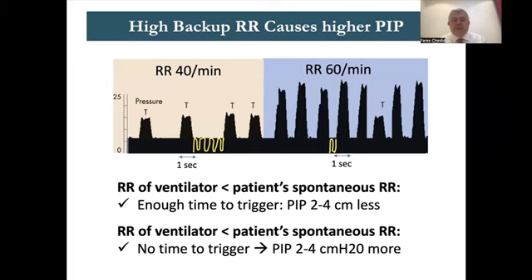If the patient is breathing 50, 55 per minute, go down to 35, 30 per minute. Let the patient breathe more than the ventilator. This way you are 100% sure of two things. First, he's not hypocapnic because he's breathing. And second, he is triggering, so he will need less PIP and he will have less barotrauma.